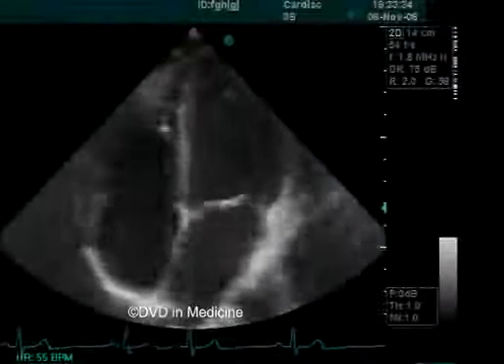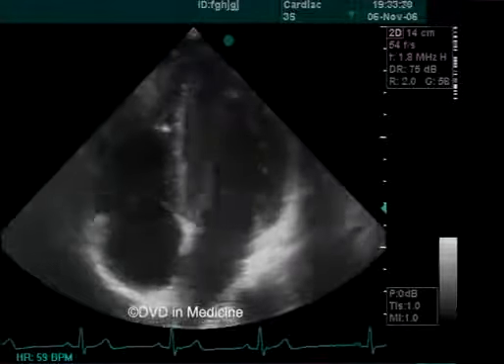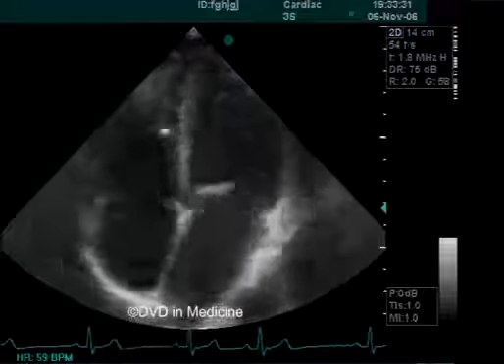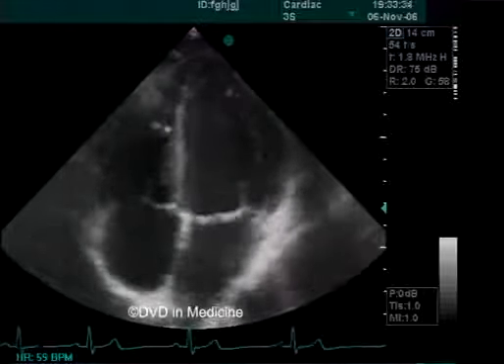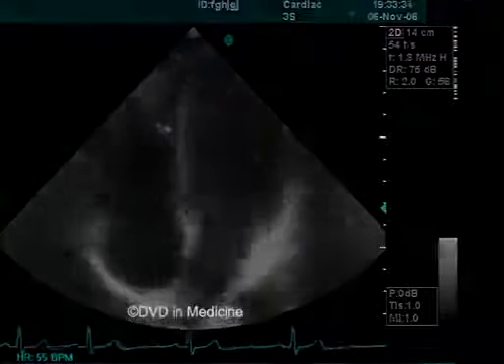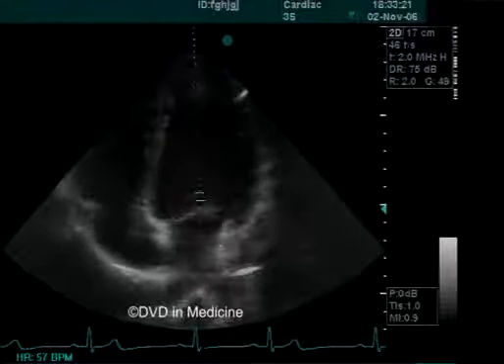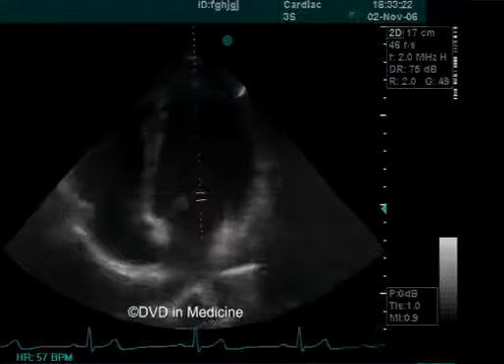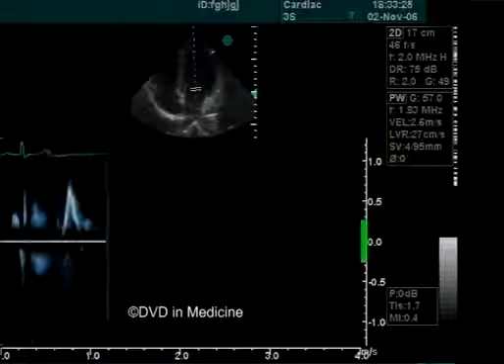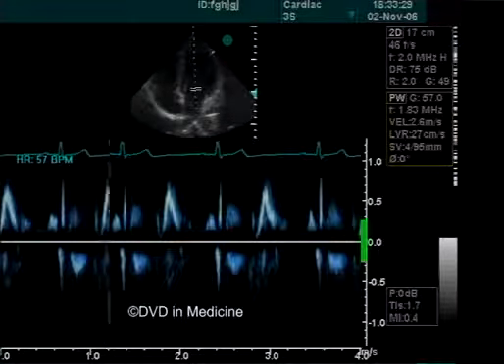During an apical four-chamber examination, one should evaluate whether the left ventricular walls contract uniformly. One must also assess the structure and motion of the mitral and tricuspid valves. This approach is ideal for Doppler recordings of blood flow through the mitral and tricuspid valves because the Doppler ultrasonic beam is parallel to the direction of blood flow.